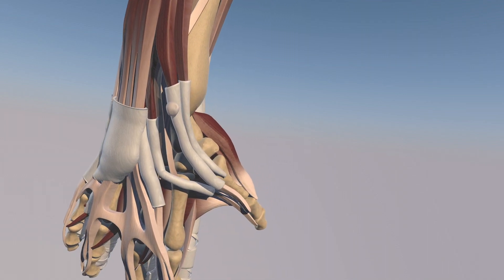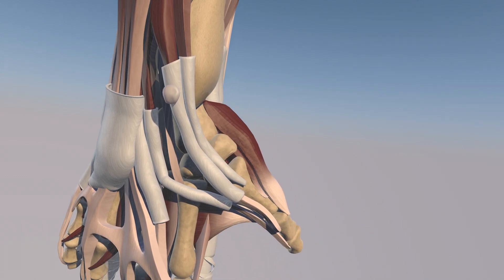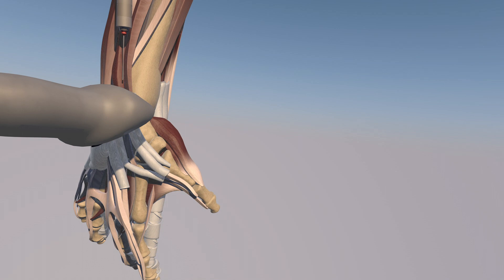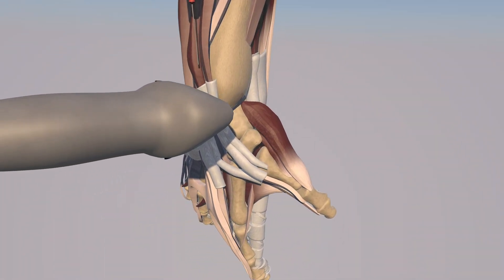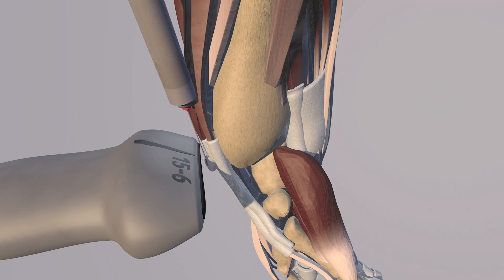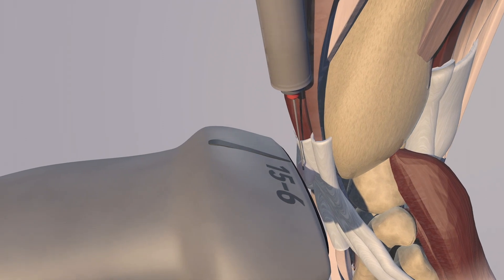Now we're going to bring the wrist into the position for the procedure. Initially we had the probe in an axial plane on the dorsal aspect of the wrist, and then we essentially just put the needle right through that ganglion. Initially we got the needle into the ganglion and injected it — maybe a little bit got within the first extensor compartment, but I wasn't convinced during the procedure.